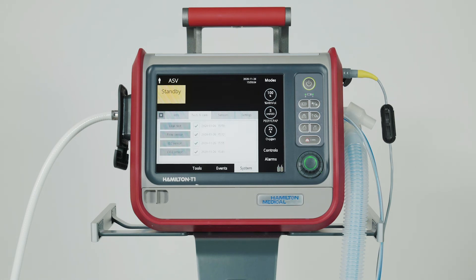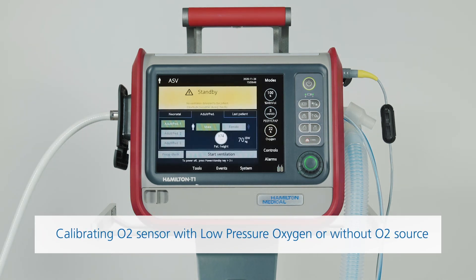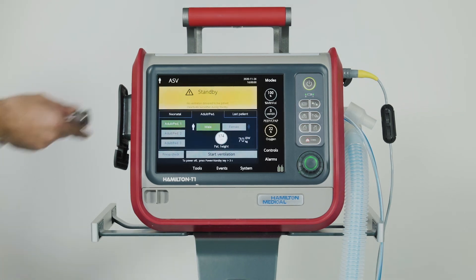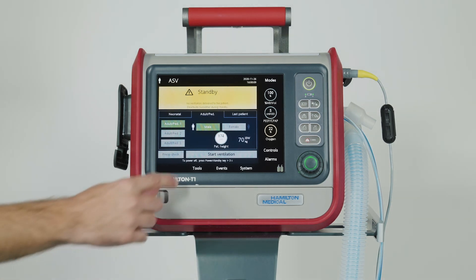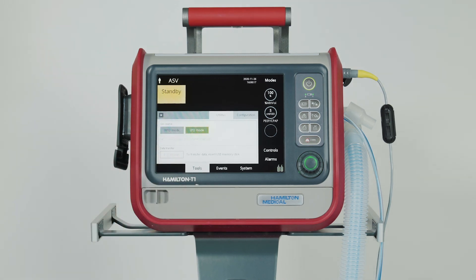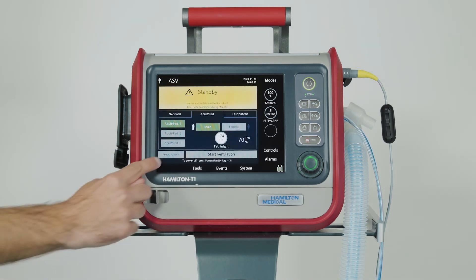If calibration fails, a red X is displayed. Repeat calibration, and if the second attempt fails, replace the O2 sensor. If you're using low pressure oxygen or high pressure oxygen with less than 99% oxygen, disconnect all oxygen supplies before you start calibration. If the oxygen supply is disconnected, calibration will be performed with 21% oxygen, regardless of the current oxygen setting.